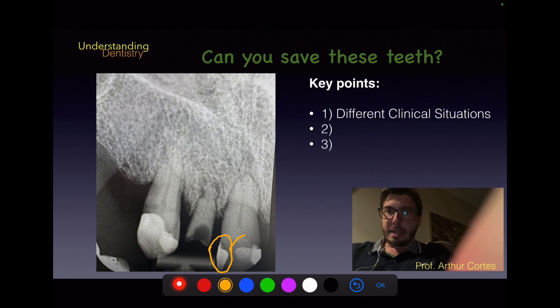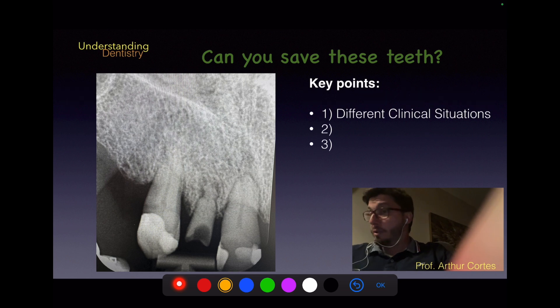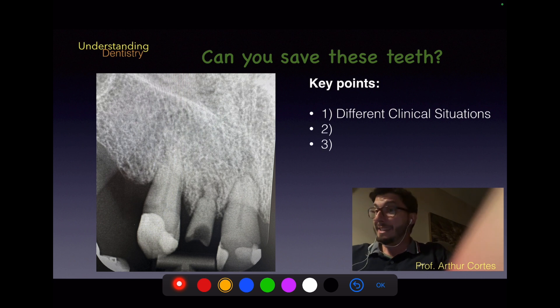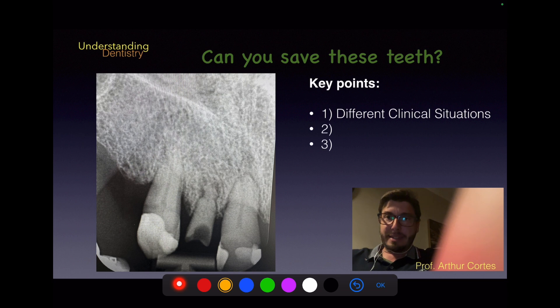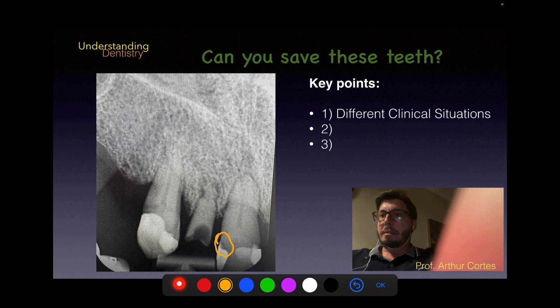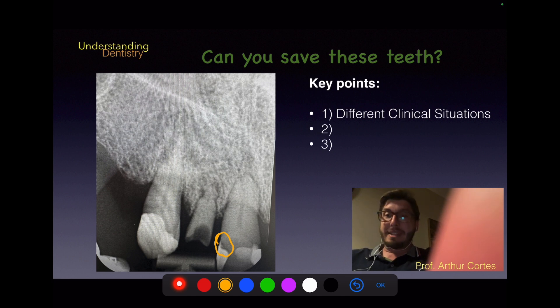On the central incisor we have two restorations: a distal restoration and a mesial restoration which is also palatal. Their adaptation is not ideal. We can see a radiolucent line, but it is not carious. There's a radiolucent image between the restoration and the dentine.